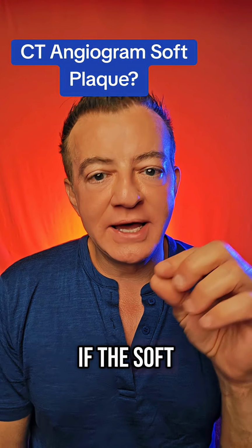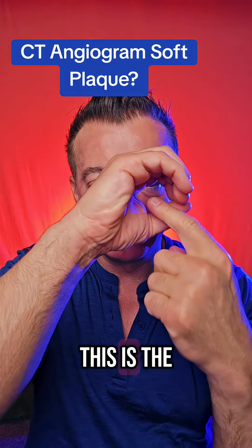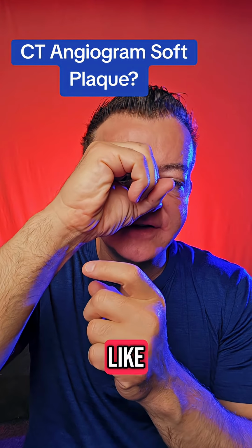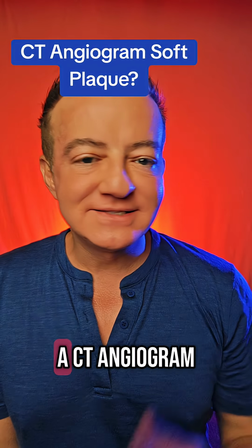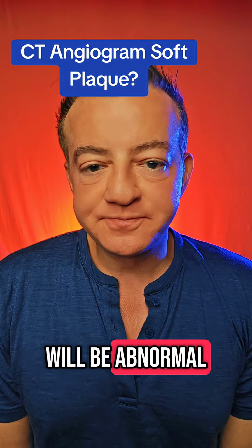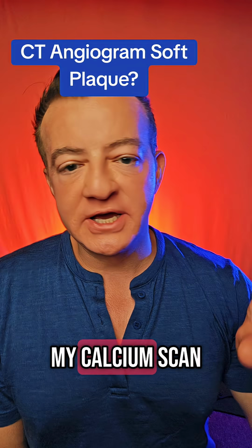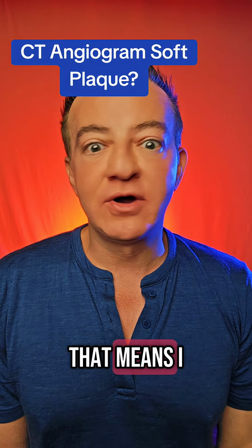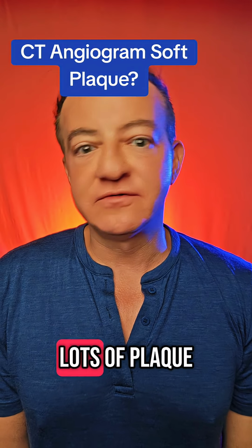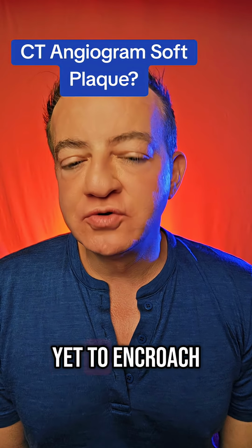If the soft plaque is encroaching on the lumen of the artery, the open part, let's say it's tight in a certain area, then a CT angiogram, where we inject dye into the lumen, will be abnormal. And I think people are not understanding that. They think that if my calcium scan is normal and my CT angiogram is normal, that means I don't have soft plaque. No, you very well could have soft plaque. You could have lots of plaque. It's just not bad enough yet to encroach on the lumen.